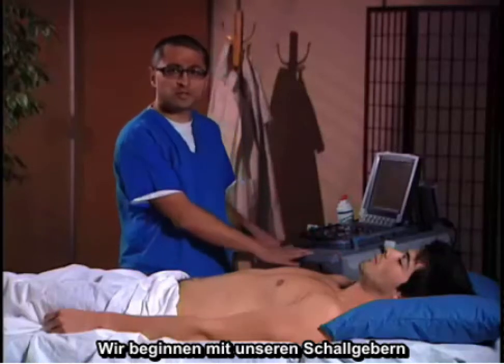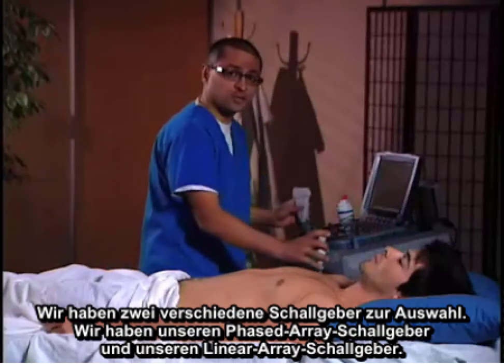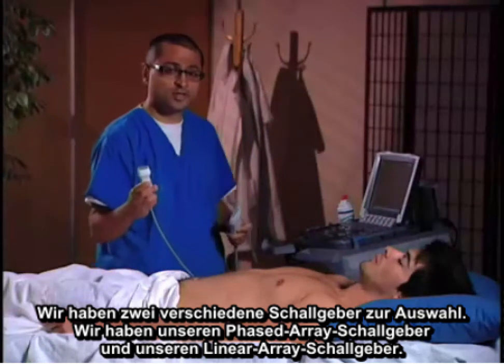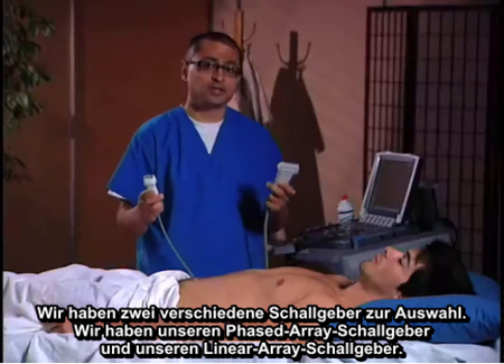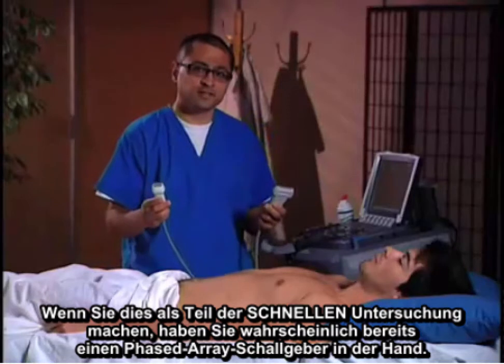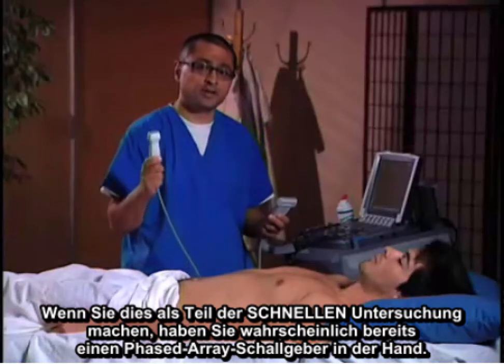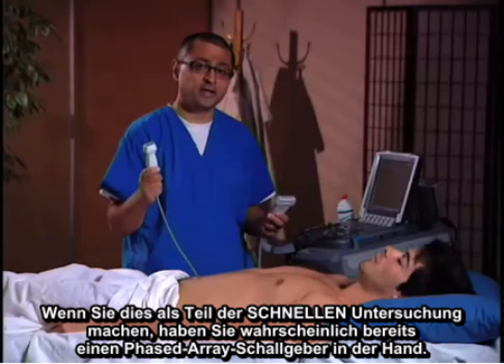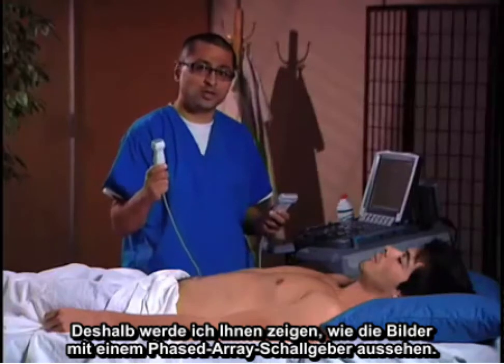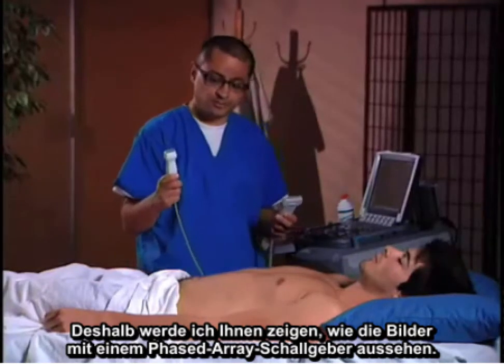We're going to start with our transducers. We have two different choices: our phased array transducer and a linear array transducer. If you're doing this as part of the FAST exam, most likely you already have a phased array transducer in your hand. Therefore I'm going to show you what the images look like using a phased array transducer.